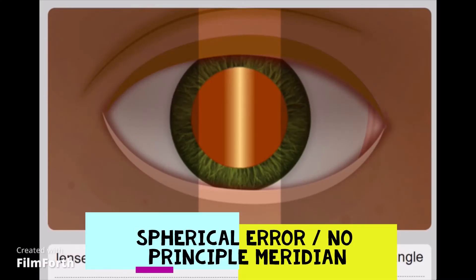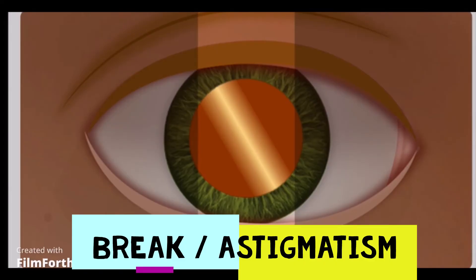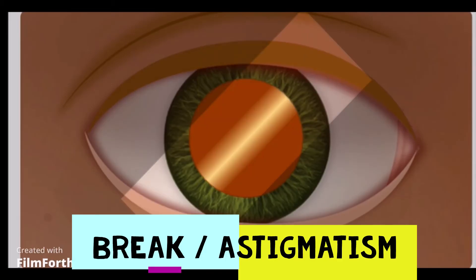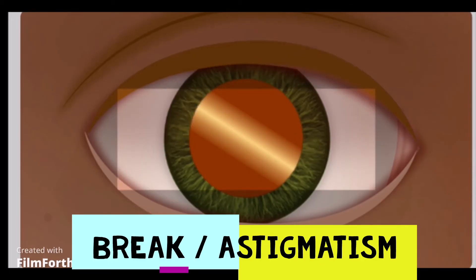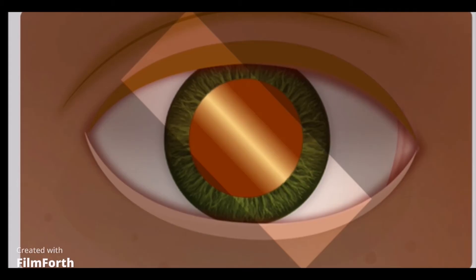In this clip you can see that in a spherical error all meridians have the same power and no matter where the streak is placed the reflex is always parallel. Now for this astigmatic patient: first the streak is placed at 90 degrees, but the reflex appears bent away. At 45 degrees the reflex is perfectly aligned — meaning one principal meridian is at 45. At 180 degrees it is not aligned, but at 135 degrees the reflex aligns perfectly. So the two principal meridians here are at 45 and 135 degrees.